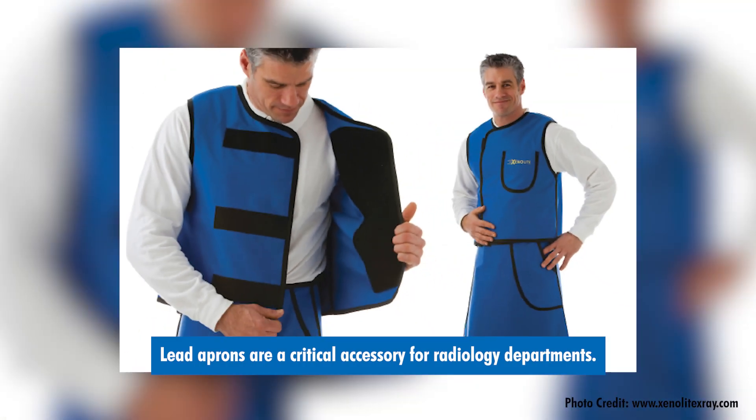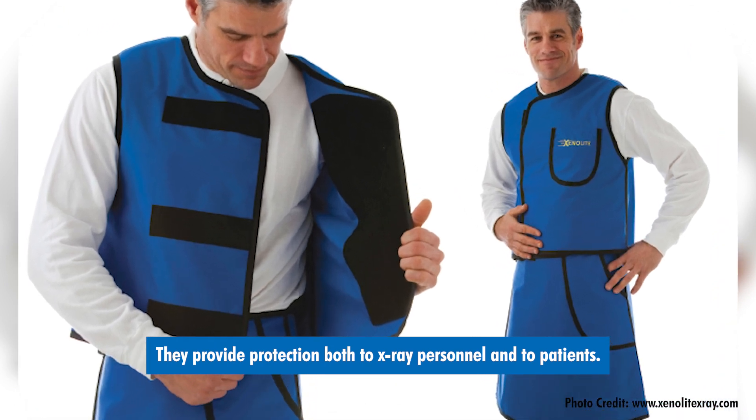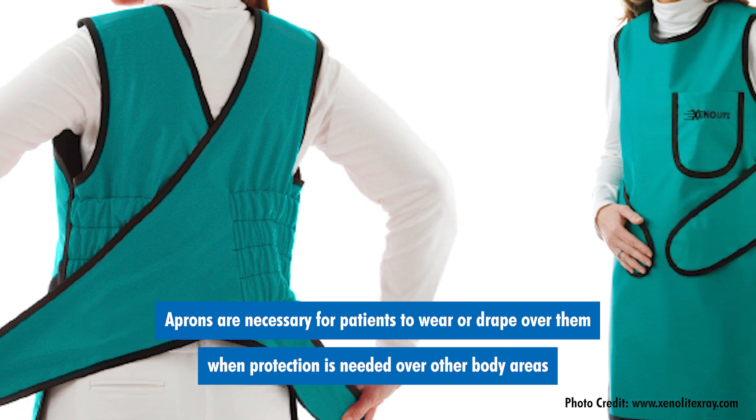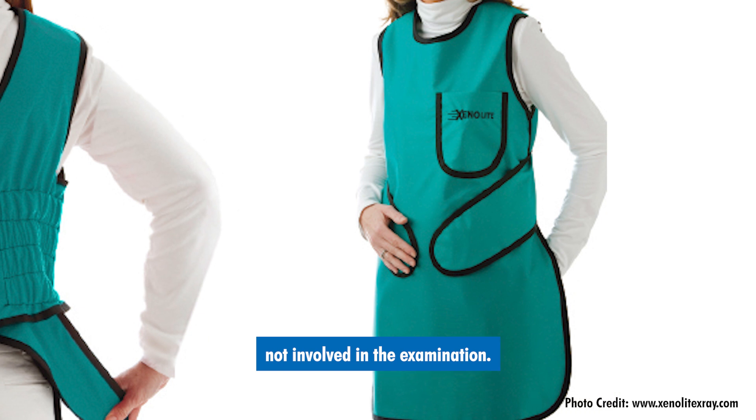Lead aprons are a critical accessory for radiology departments. They provide protection both to x-ray personnel and to patients. Aprons are necessary for patients to wear or drape over them when protection is needed over the body areas not involved in the examination.